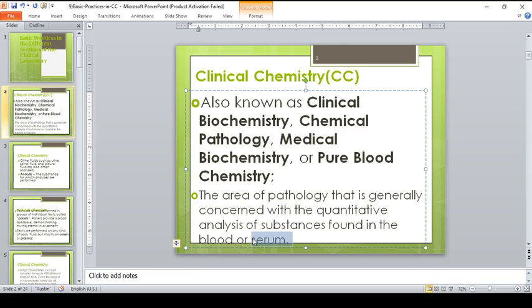The HbA1c test actually measures the sugar component that is present in hemoglobin. It is a long-term measure of the sugar content. For diabetics, it measures almost 2 months of the sugar in the blood. Why does HbA1c use whole blood?